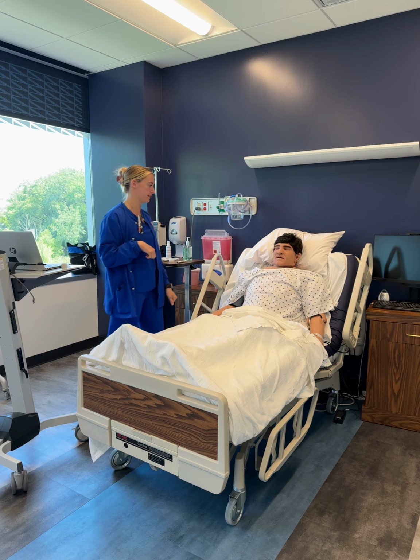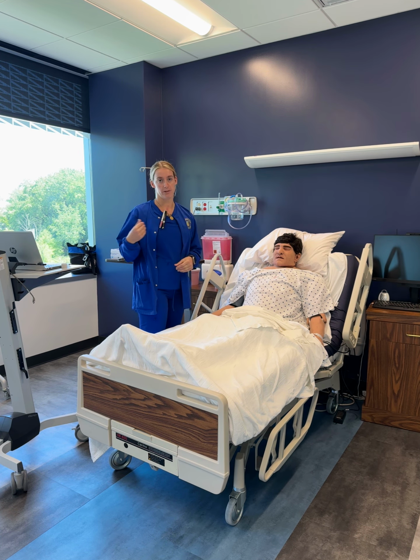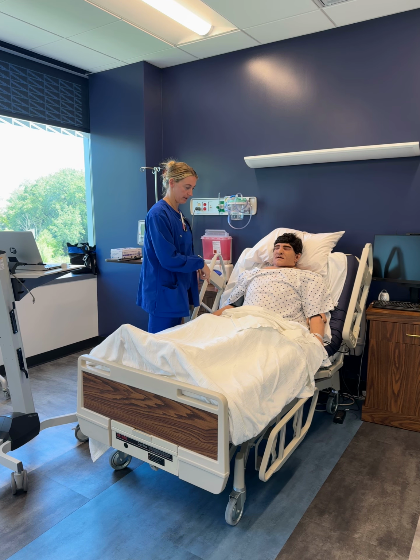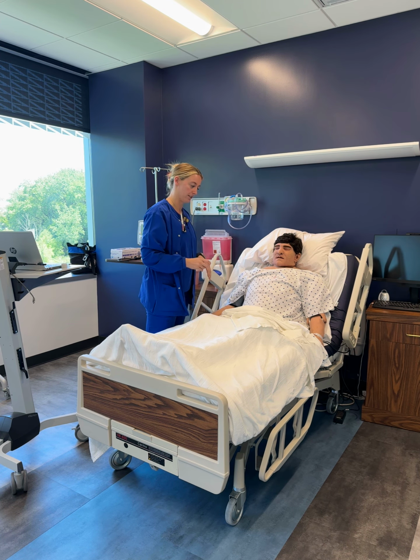Knock, knock, knock. Hi, my name is Bree. I'm going to be your nurse today. I have verified the orders for a patient to get an NG tube insertion due to bowel obstruction. I'm going to do 2 patient identifiers, name and date of birth. Patient has done that and is concurrent with their wristband.